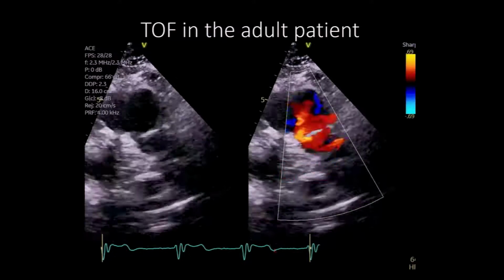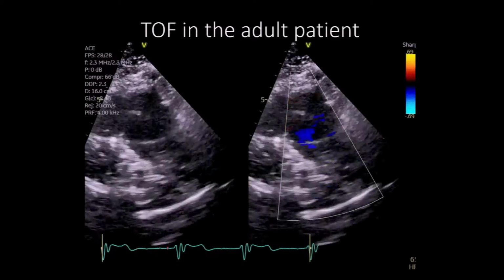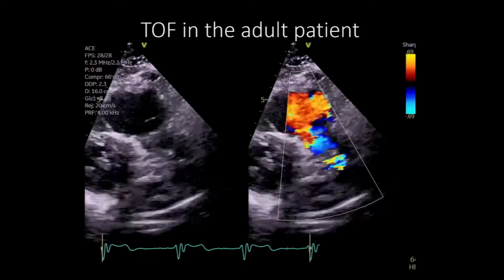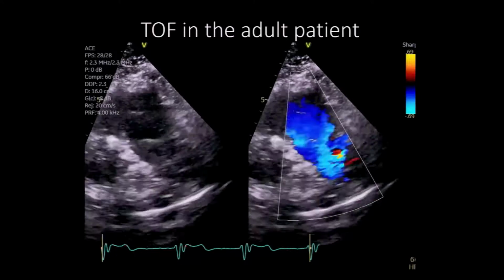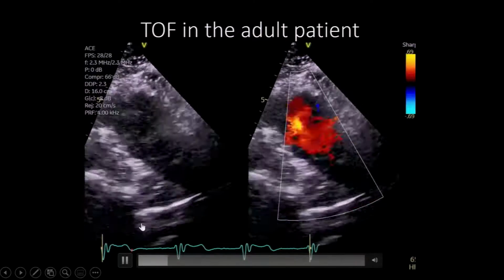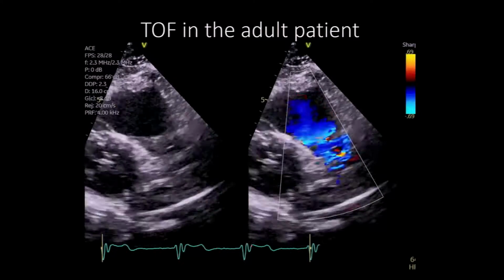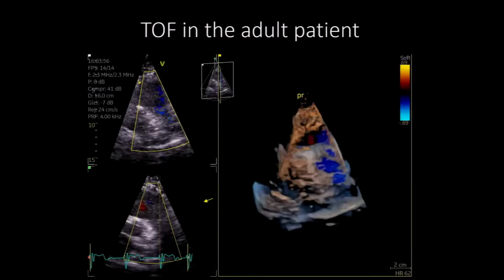And the same goes when you're examining them in clinic. Like the fellows that work with me in clinic can tell, the murmur is very short and faint sometimes. So you have to pay attention. And in echo, you need to go sometimes frame by frame to not miss this. And also, the flow doesn't look as turbulent, and so it's frequently missed. So always, tetralogy flow patients, look frame by frame. Otherwise, you may miss severe pulmonary regurgitation.